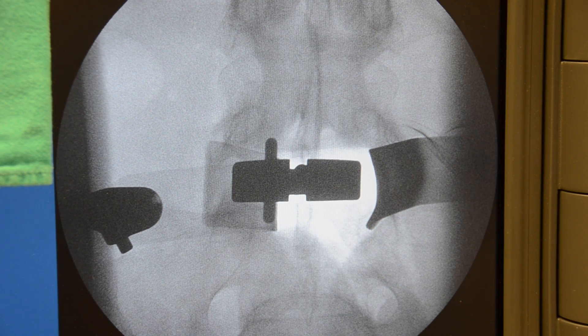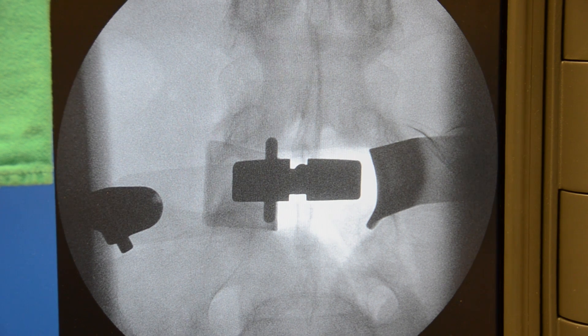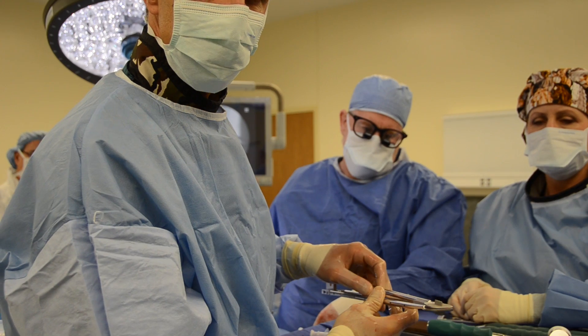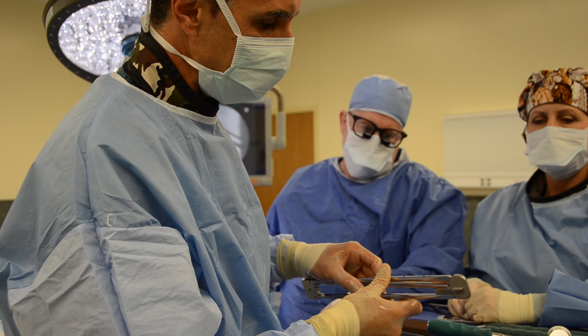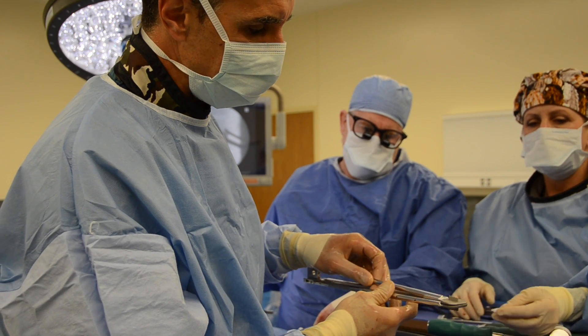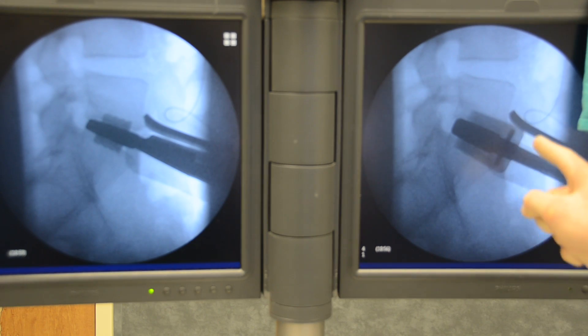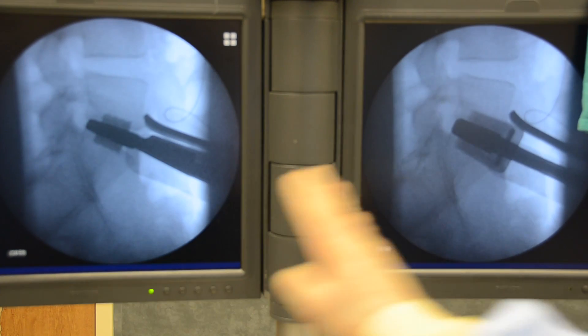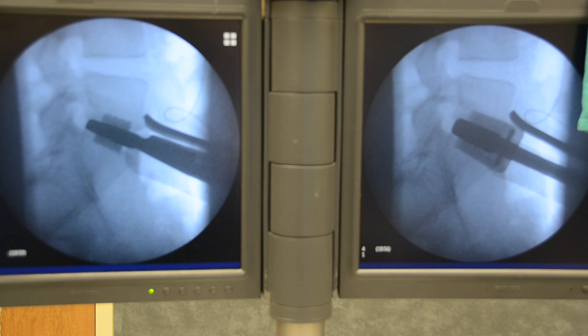An AP view is taken to confirm that the trial is placed in the midline so that the disc is ultimately placed directly in the center of gravity of motion. The chisel is tapped down the midline to place a cut for the fixation of the disc. We've sized for the correct ProDisc L. The three-piece disc — two end plates — will go in first. Here's the artificial disc end plates tapped into position, and we have the perfect match radiographically.